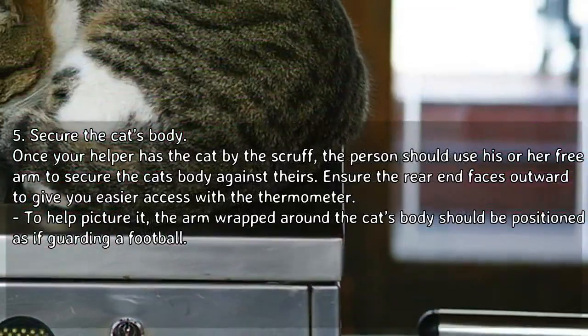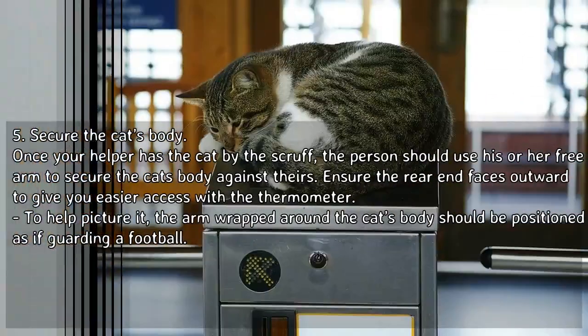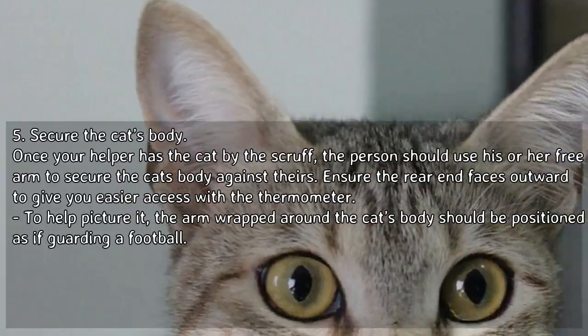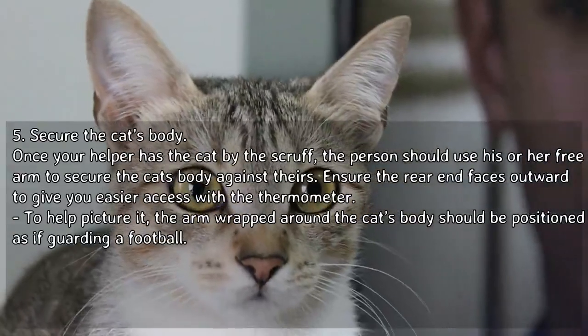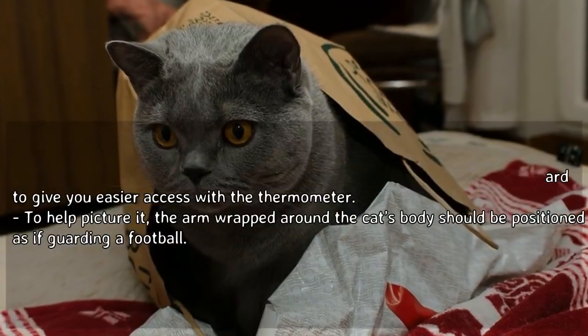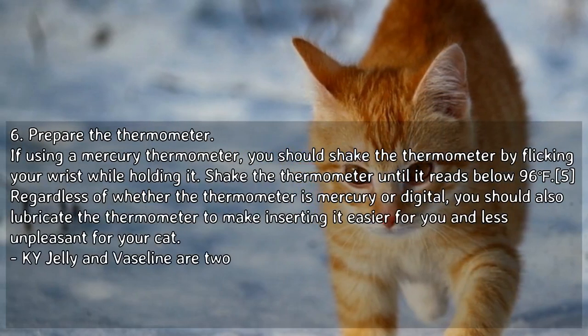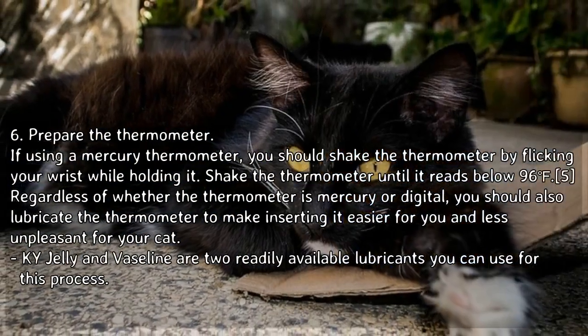Once your helper has the cat by the scruff, the person should use their free arm to secure the cat's body against theirs, ensuring the rear end faces outward to give you easier access with the thermometer. The arm wrapped around the cat's body should be positioned as if guarding a football.